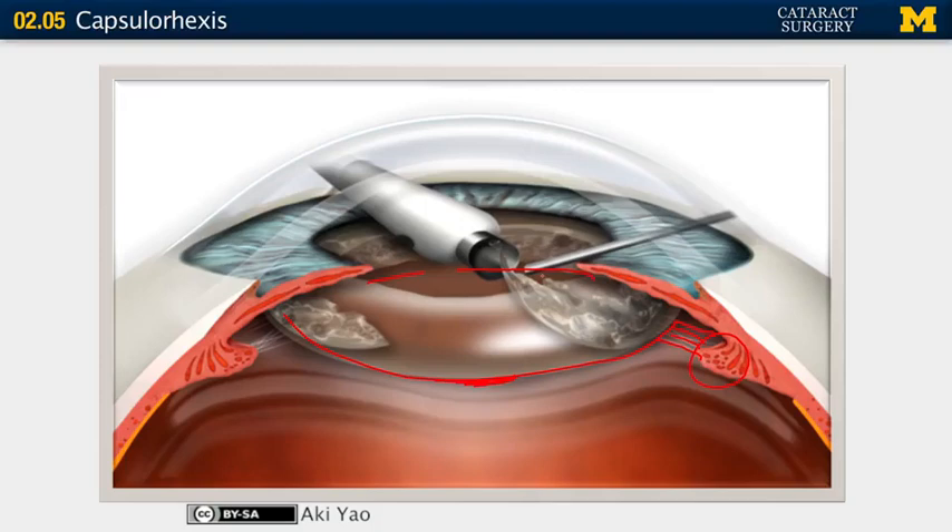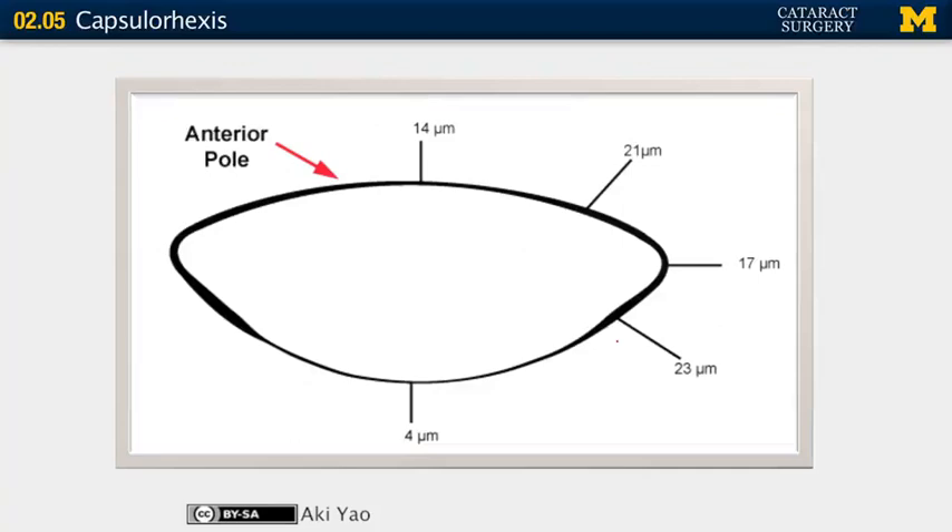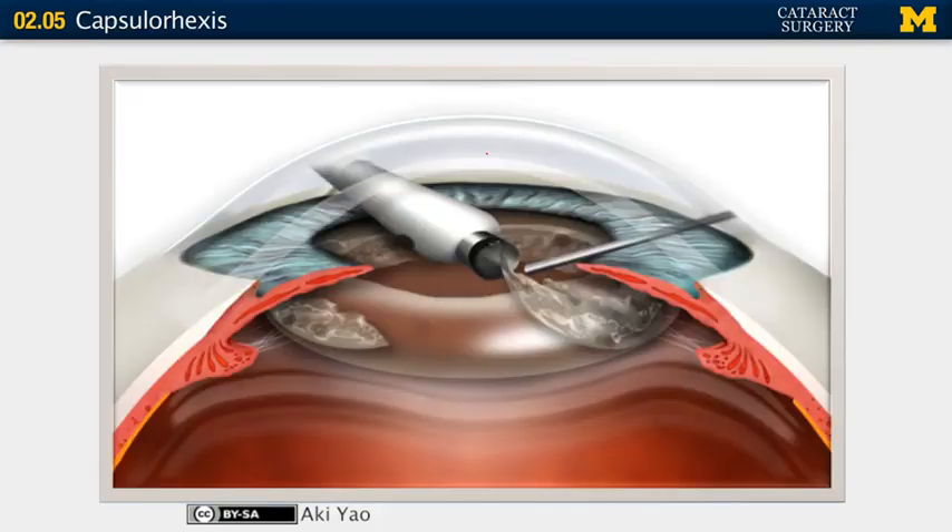The goal of capsulorhexis is to make an opening in this basement membrane — yes, the capsule is the basement membrane of the lens epithelium. The goal is to make an opening in that basement membrane leaving the rest of the natural bag intact for the entire case, so that you can put the artificial lens in that natural bag. Four microns separating you from the vitreous, and 14 microns that you're going to be manipulating — a very challenging part of the case.